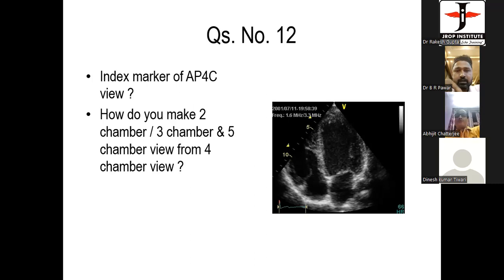Next, what do you do? You take the midpoint of the straight line and join it to the distalmost point. Doctor, you have answered well, and I'll give you marks for this. But tell me, have you been guessing or did you know this? No, sir. I know. In the lecture before last, you explained this, but I couldn't read it properly. I just remember whatever.